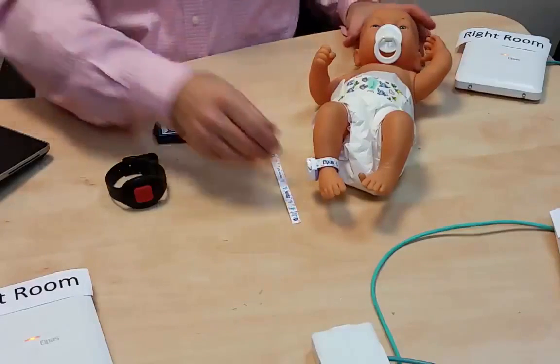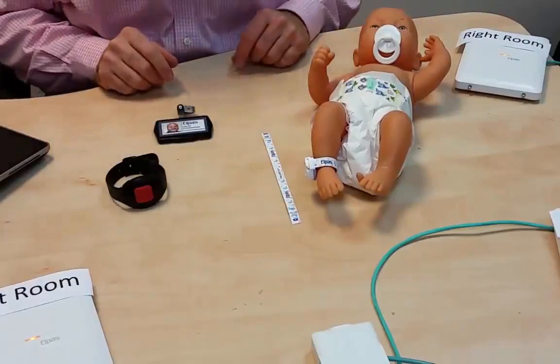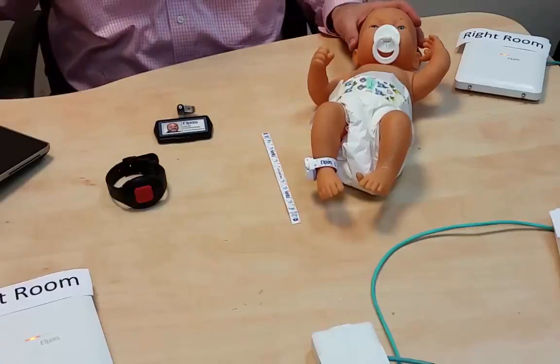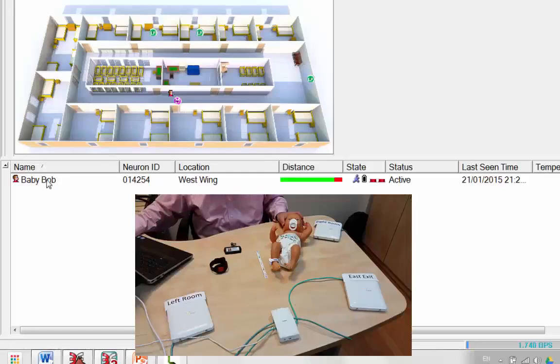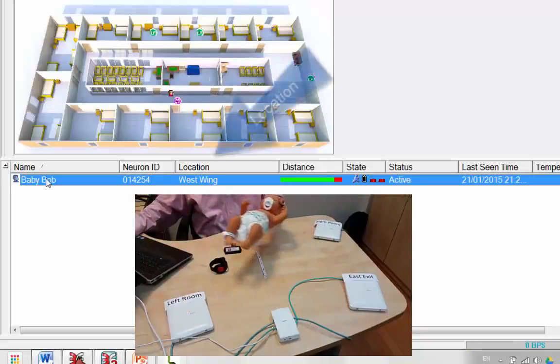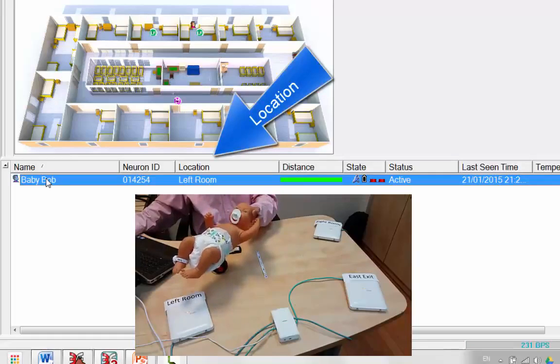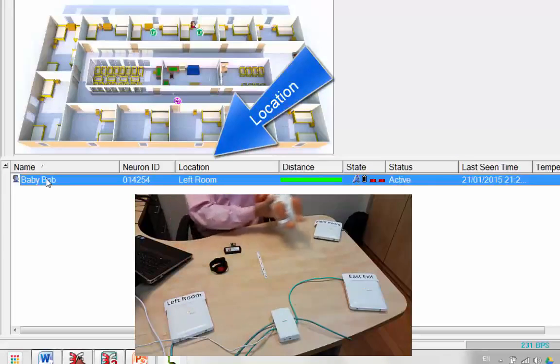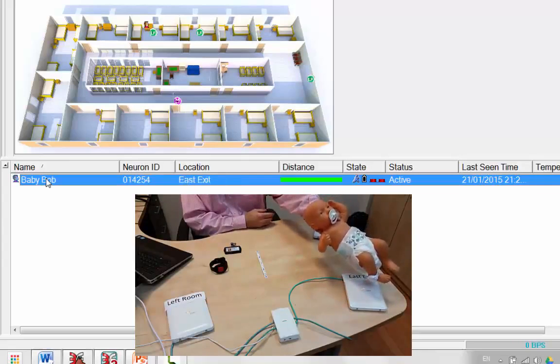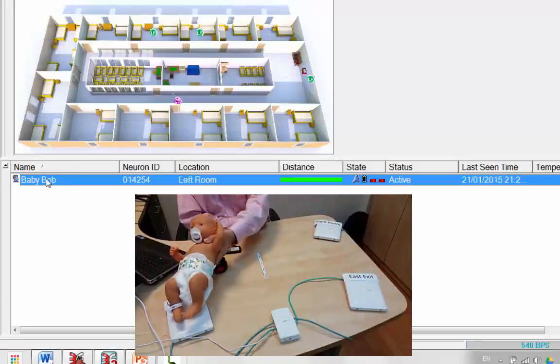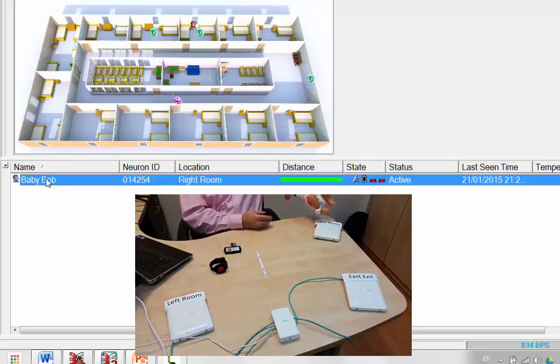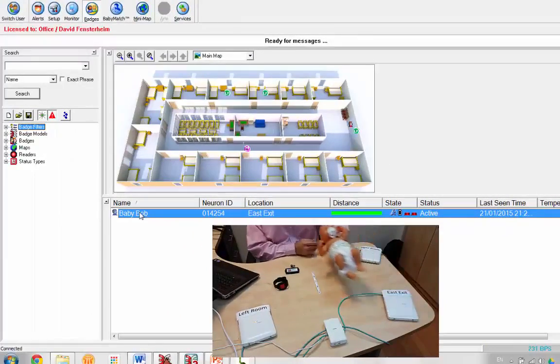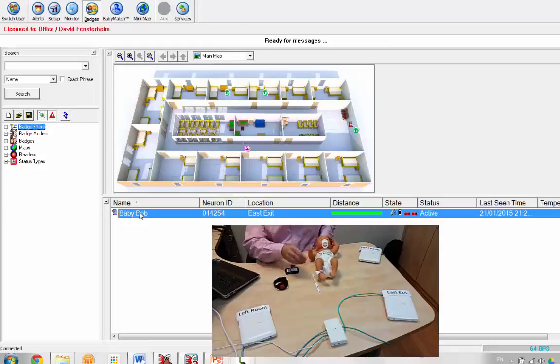This time, our infant is secure. Let's have a look at our badges here. So we've got baby Bob currently showing the left room. So that's our left room, right room, into the east exit. Again, left room, right room, and east exit.